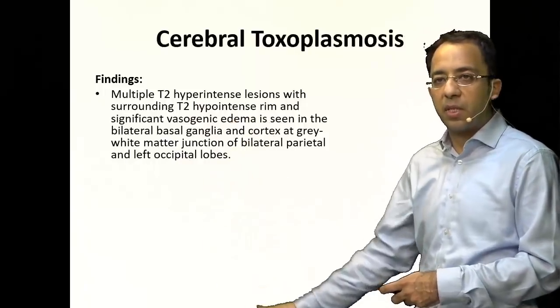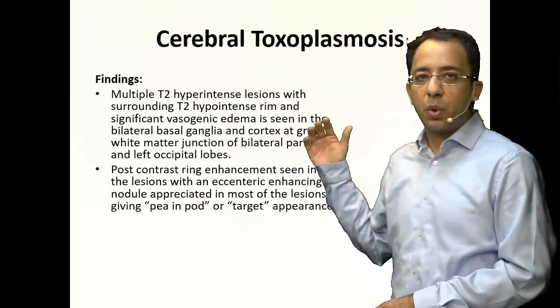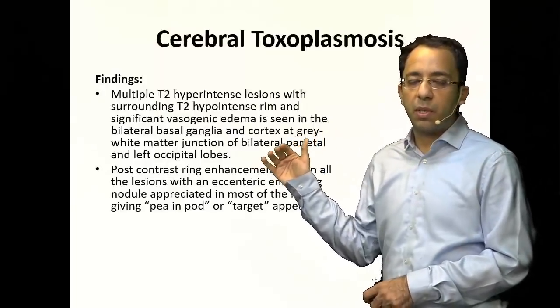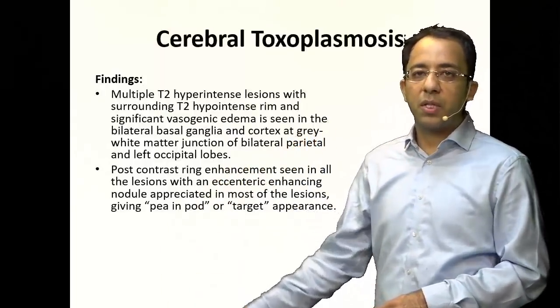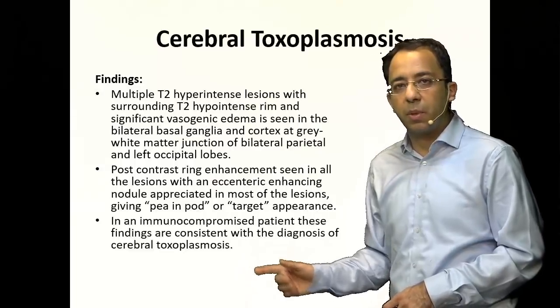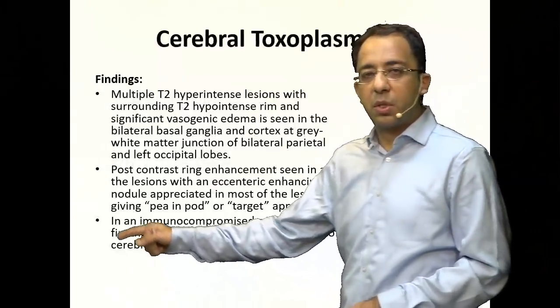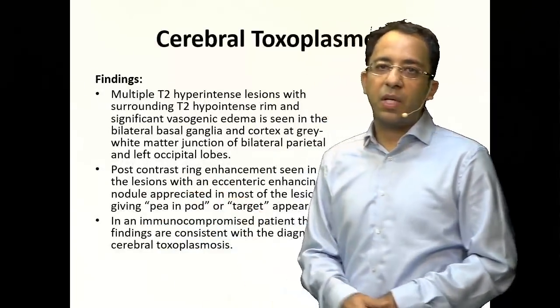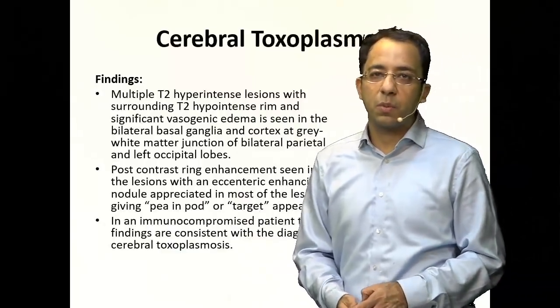To summarize the findings: multifocal lesions in the basal ganglia and gray-white matter junction area, with the contrast-enhanced image showing eccentric enhancement and a nodule within — called the eccentric target sign. This is very typical of CNS toxoplasmosis in an immunocompromised patient.